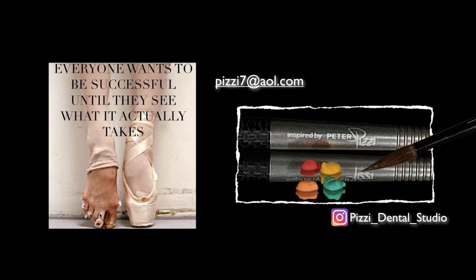But if I messed up and put too much glaze on and I glazed it, I would probably come back and re-add some of the surface topography, and then either re-glaze it at a lower temperature or just polish it, right? I would really break in there with some diamond paste and some pumice polish if I needed. Actually, I have a system from the Dialite system where I have a few different polishes, one a little more coarse and one a little more fine. So you can get in there and polish everything up rather than have to refire it again.